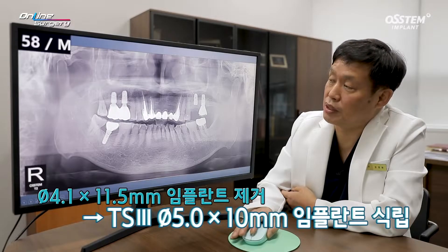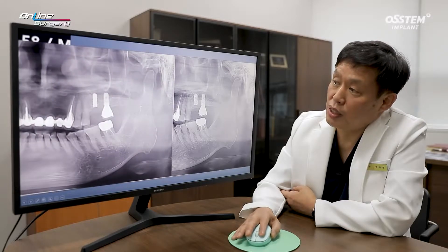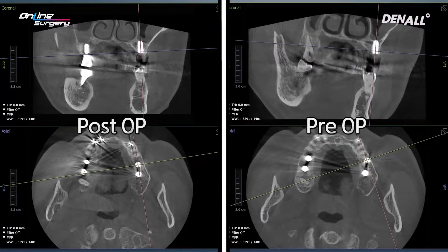It was placed slightly deep, and the position looks good. I removed the S implant of diameter 4.1, and on the same area a 5.0 x 10 mm implant was placed. In the post-op image, you can see that the TS3 5.0 x 10 mm implant was placed where the fractured implant used to be. The position and distance with the posterior implant are all good. The new implant has been placed in the desired, more palatal position compared to the buccally inclined fractured implant.